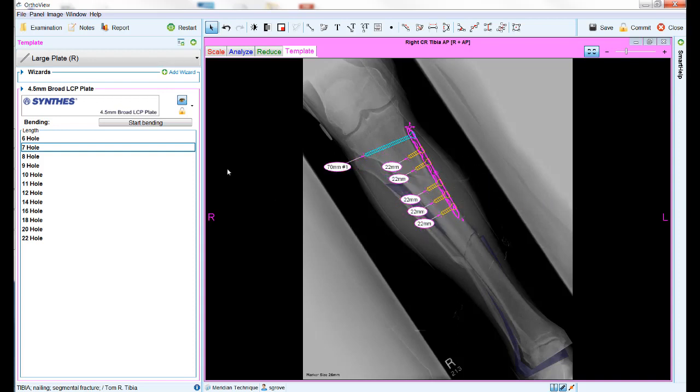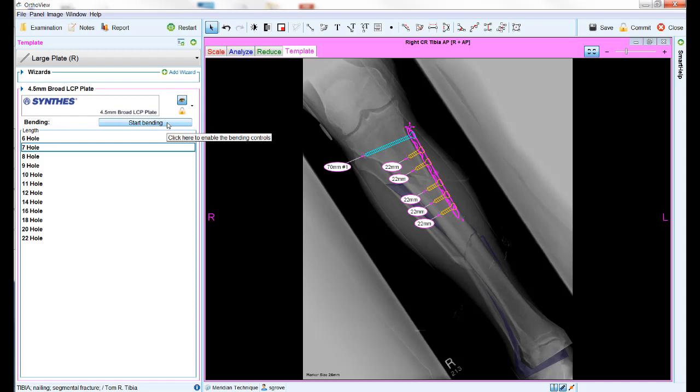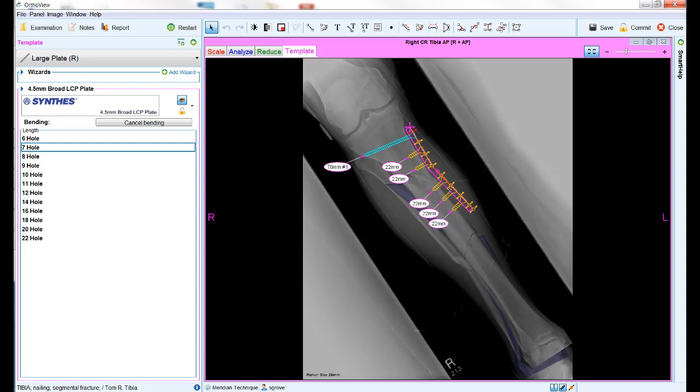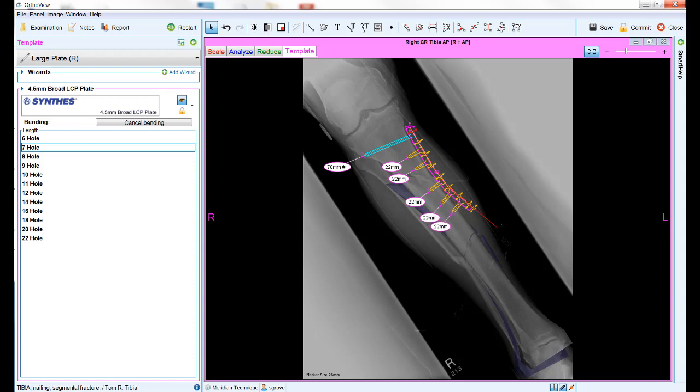Finally, the software provides the ability for some plates to be bent or contoured to match the bone. If the template you are using has this ability, the start bending button will appear below the template banner. The button provides a series of control points along the length of the plate which can be left clicked and dragged to allow the plate to be bent in either direction. Use the cancel bending option to revert back to the original straight plate.